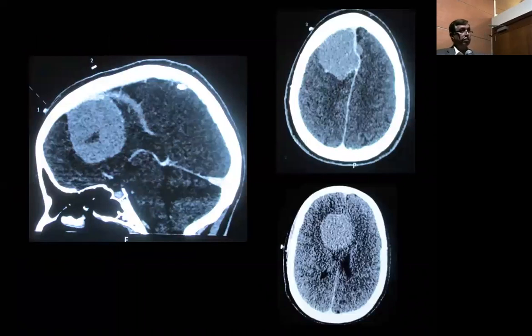This is the CT scan that we have done, and we use it also for navigation. To help her financially, instead of doing the navigation MRI, we did this. We put some capsules of calcium on the scalp so that it would help us localize where the tumor is. This is called poor man's navigation.